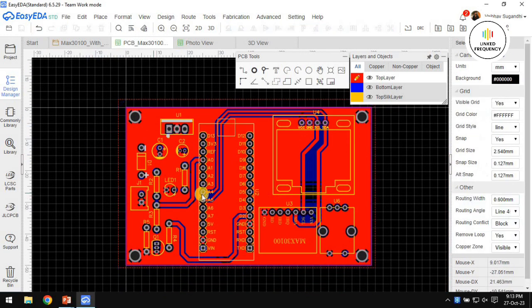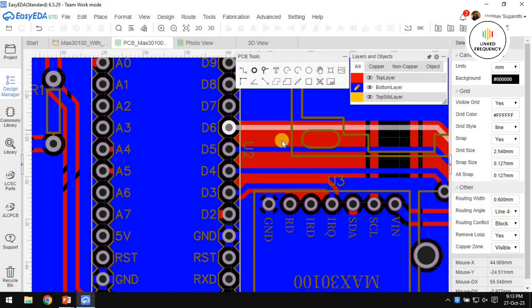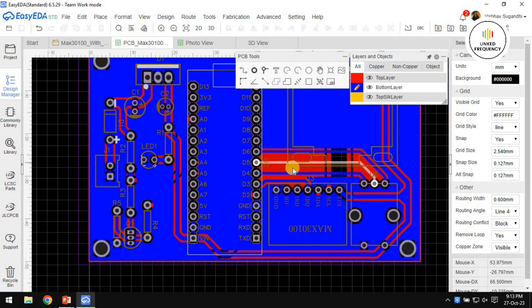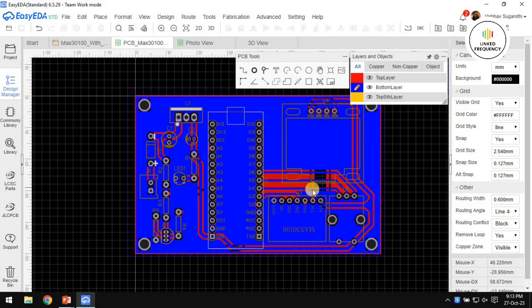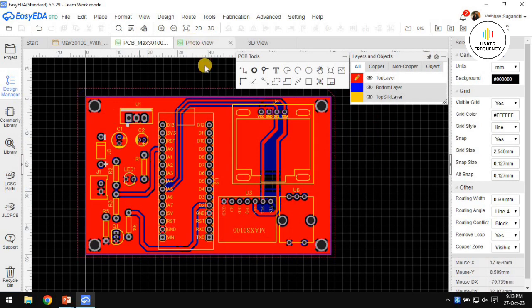Other than that, you can see that routings are done with a 0.6 mm track width and a 1 mm track width. For power and for most of the connections, we have used 1 mm because we have sufficient space and a lot of clearance between one connection and another. For some connections where it is not possible to go with 1 mm, I have used 0.6 mm. You can still increase it to 1 mm, there is no big deal. It is still possible, but that's okay. It's a personal choice.